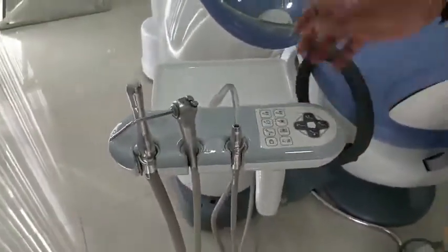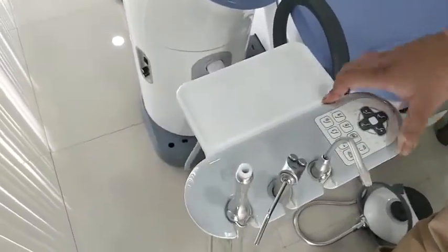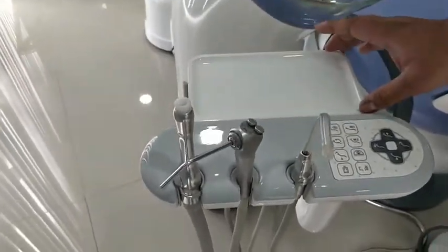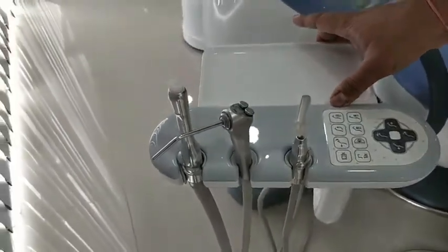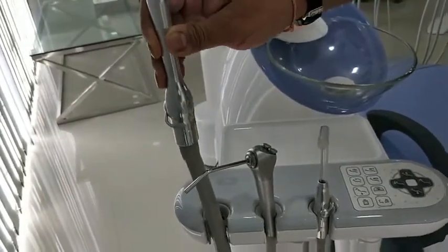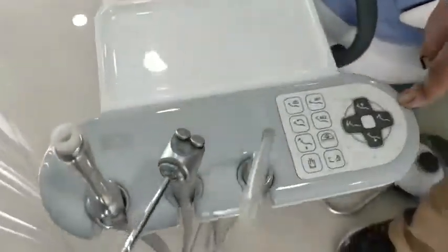Now we come to the assistant side of the chair. There is a small table on the assistant side for keeping instruments, tissue paper rolls, gauze pieces, or anything used during dental procedures. There is also a high suction for surgical procedures, a two-way syringe, and a low suction.